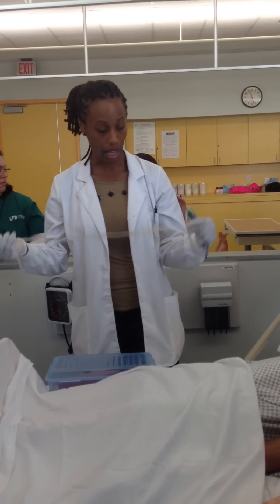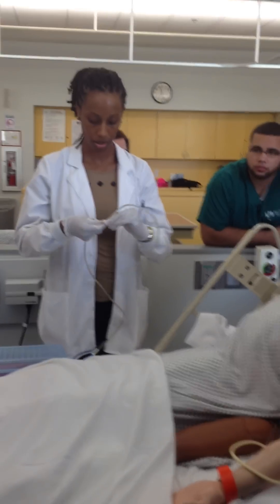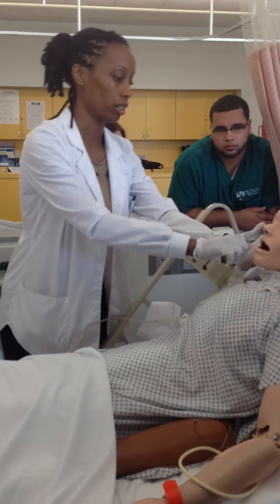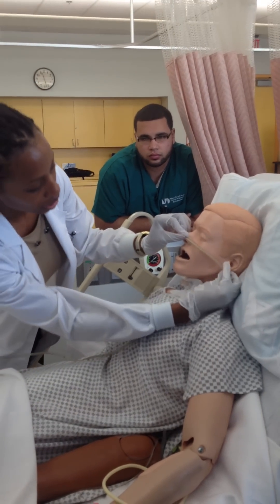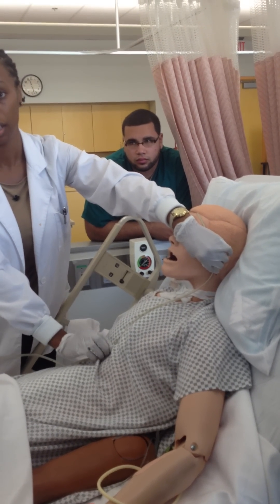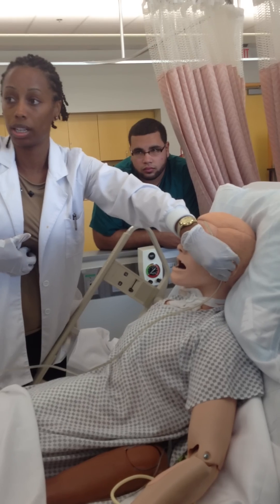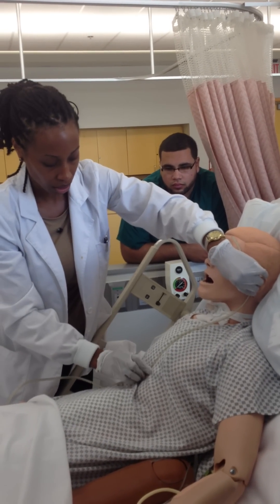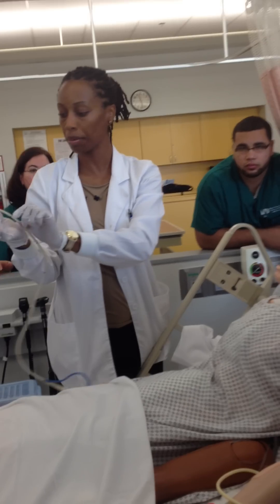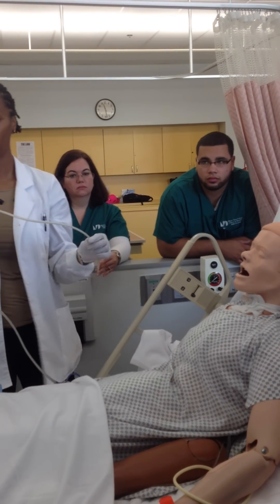What you want to do is measure. After you get this out of the packaging, you need to know about how far you're going to have to go in. You go from the tip of the nose to the tip of the earlobe, hold your finger there, then from the tip of the earlobe to the xiphoid process. On most patients, your stomach is a little below there, so you're going all the way down. Once you find that point, you can mark it with a black marker, or if it falls on one of the black marks, you note that. Or just take a little piece of tape and wrap it around to give you an idea — you at least need to go there before you stop.